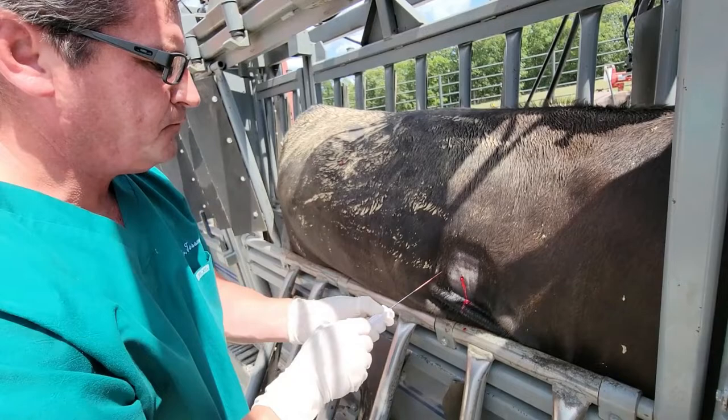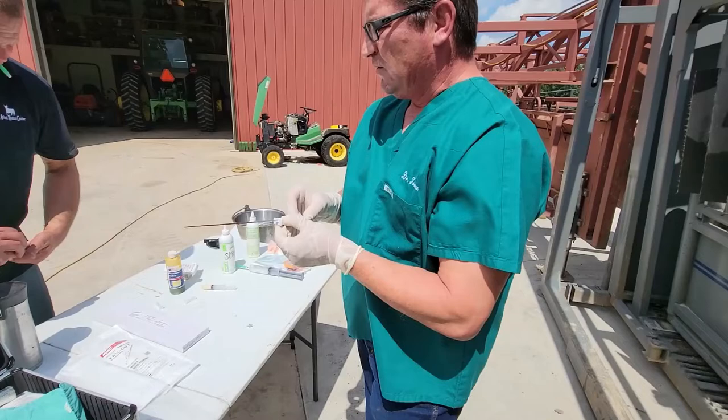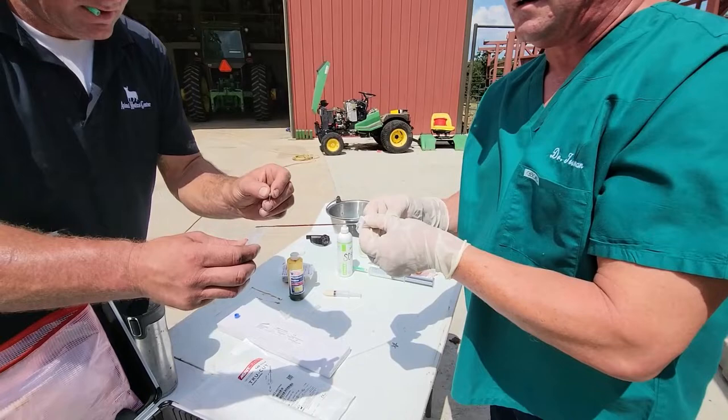We should feel a pop — there, we felt a little pop. Go forward a little bit more, and there we go — we got a nice little liver sample. With the needle, just tease that over into the sample container.